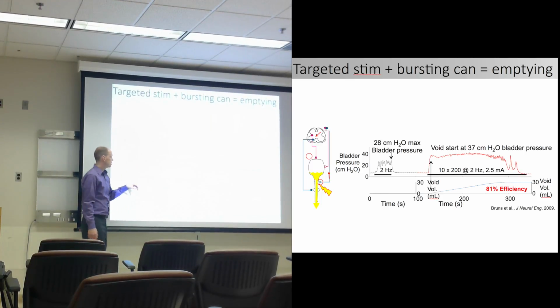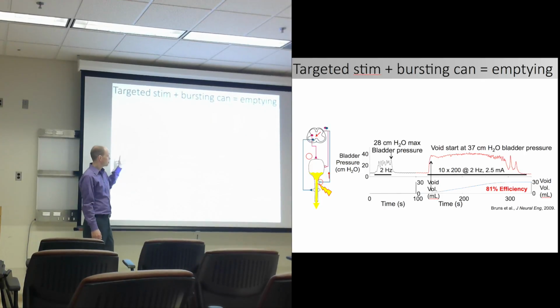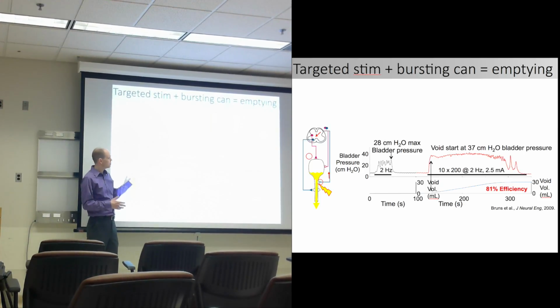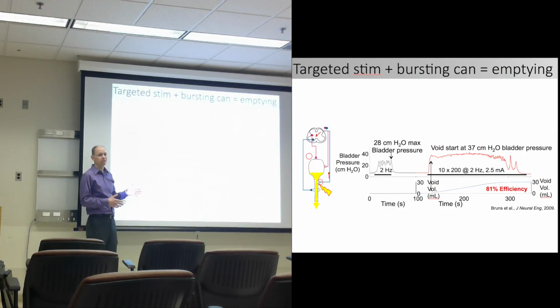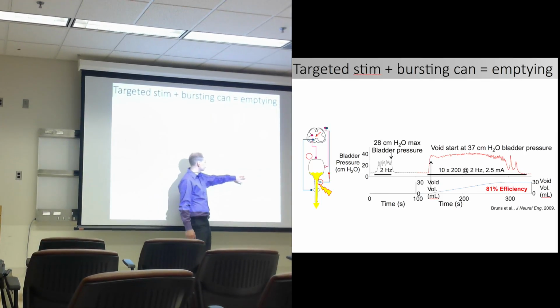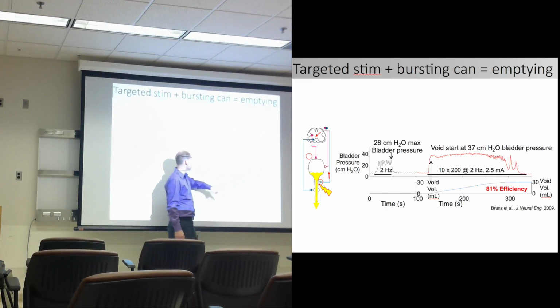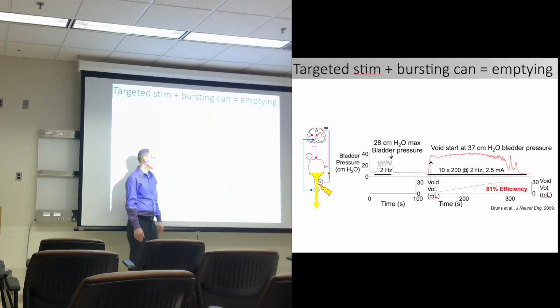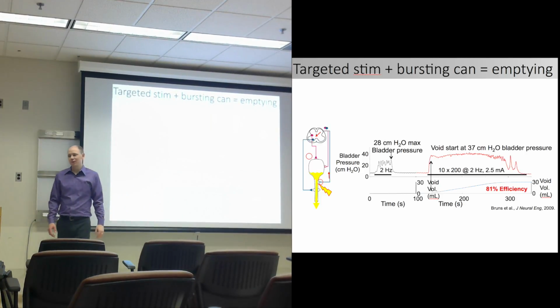But there are a couple of drawbacks to this. One, this is a pretty invasive surgery. Two, the stimulation approach is only targeting the bladder's emptying. It would be nice to have something that can also target the storage phase. Third, you also have to monitor the bladder state, and if you keep stimulating, you can stimulate when the bladder is not excited. The other factor is that in this model of the cats, they had about 30 ml voided out in a couple of minutes. So that's a lot faster.